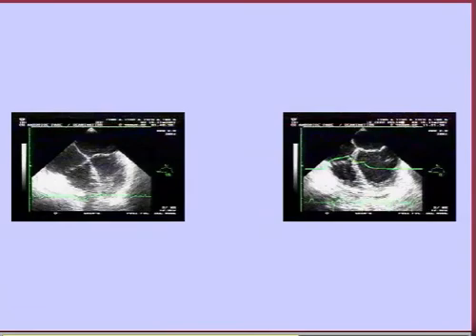Look at the situation now. The situation is very different, with a severely depressed left ventricular contractility. And so maybe in this situation, according, of course, to the clinical scenario and according to the blood pressure, the base deficit, the lactate level, and the urinary output, you may decide to infuse dobutamine.